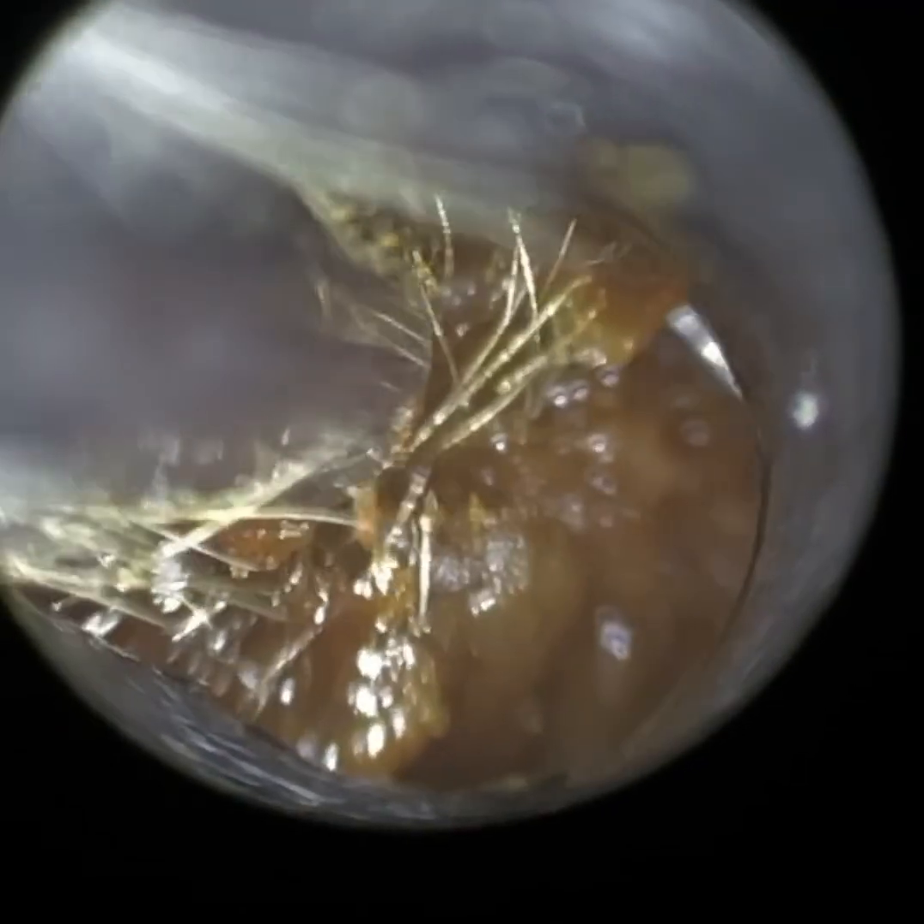When I was previously performing earwax removal using loops or an ENT microscope, I found it hard to get the focus every time I'm removing a piece of wax. I also found that the instrument can sometimes become a bit blurry and distorted. You can see just how crystal clear it is — in fact, you can see every single hair strand.